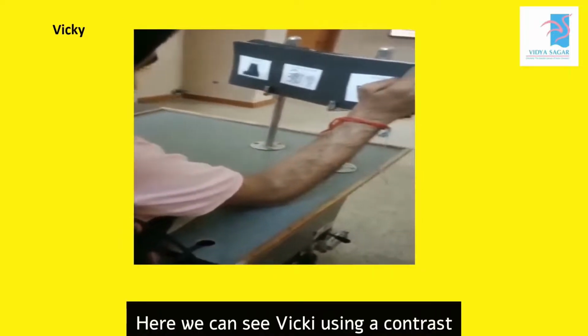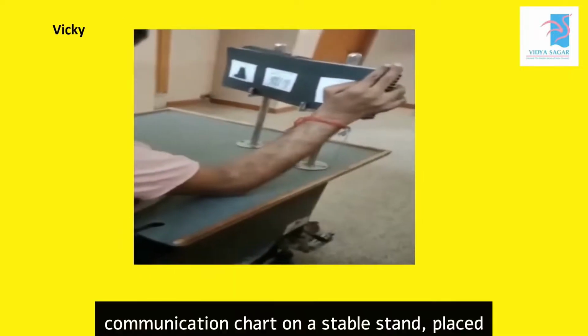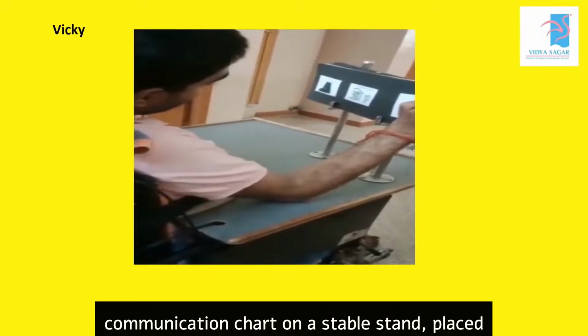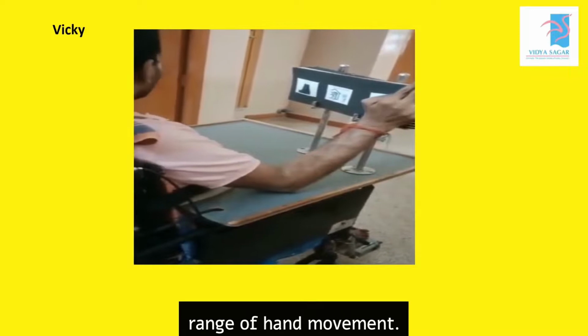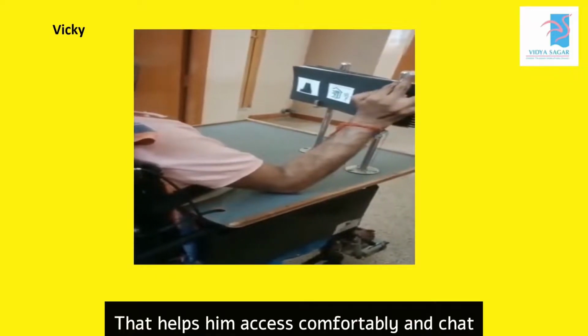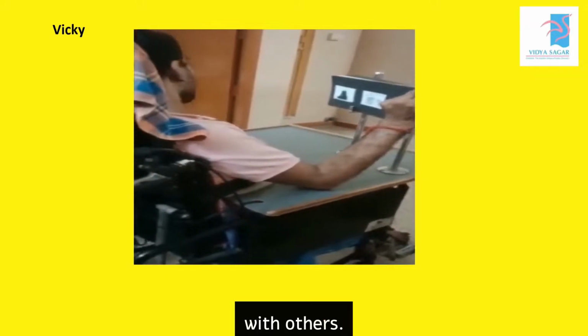Here we can see Vicky using a contrast communication chart on a stable stand placed from mid to right within his visual field and range of hand movement, which helps him access it comfortably and chat with others.